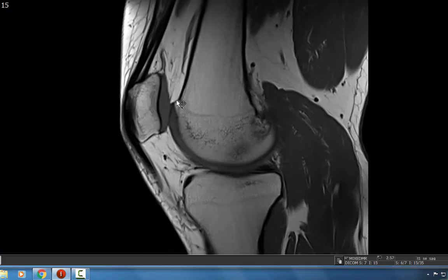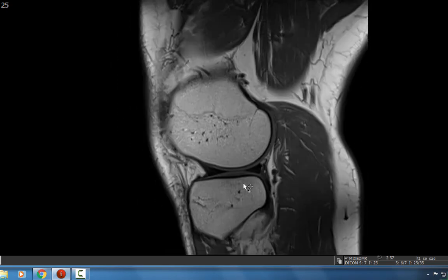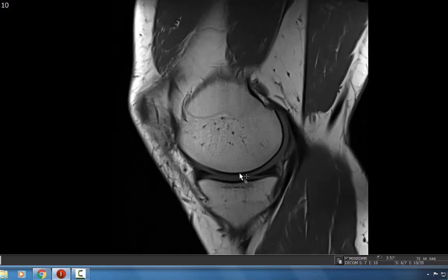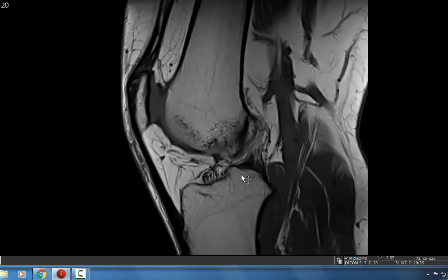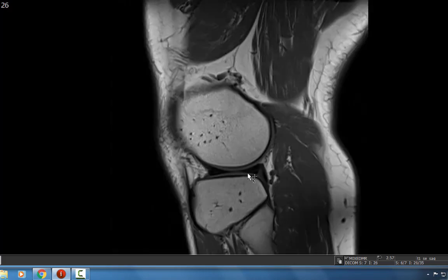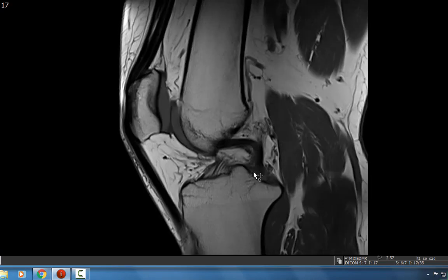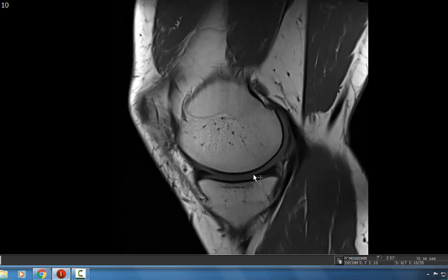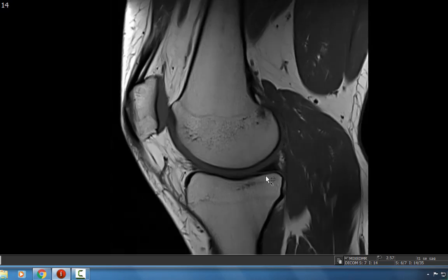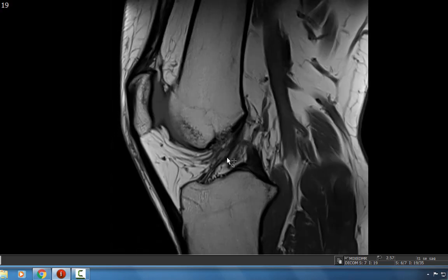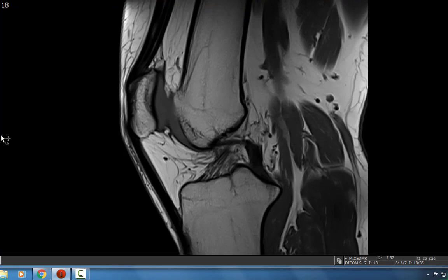I look again at the T1 to make sure the marrow looks good. The articular cartilage here is nice and gray with intermediate signal and nice thick cartilage. The menisci are also nice to evaluate on T1 — we don't see any signal approaching the articular surface to suggest tearing, just some intra-substance signal within normal limits. The ACL and PCL are both visible and intact here.